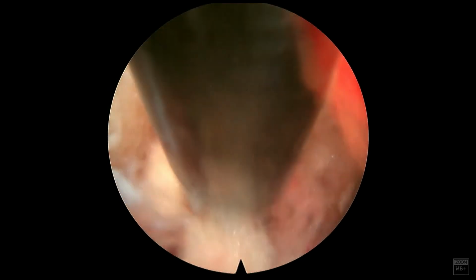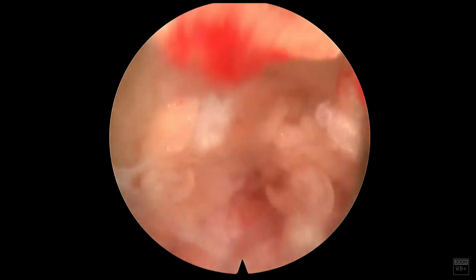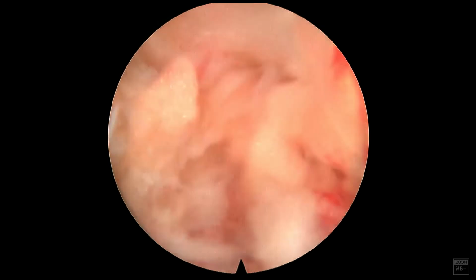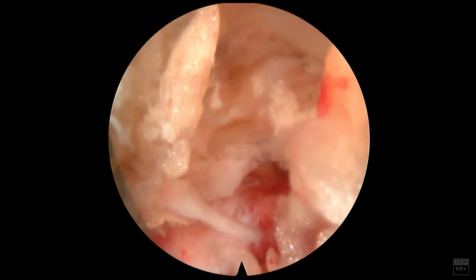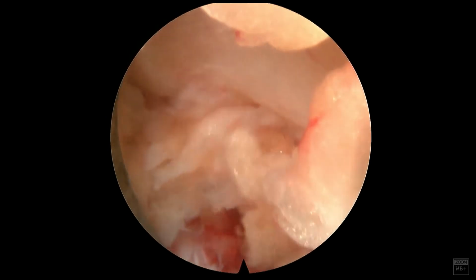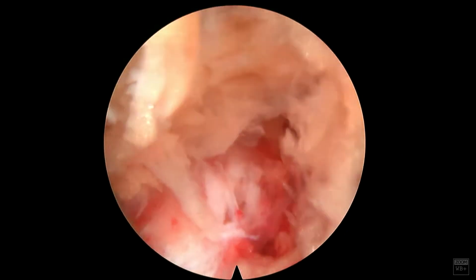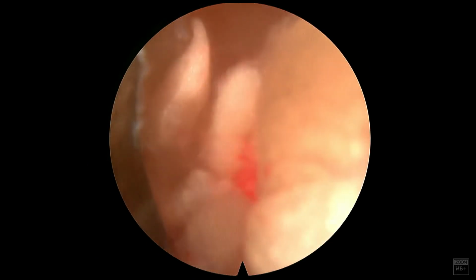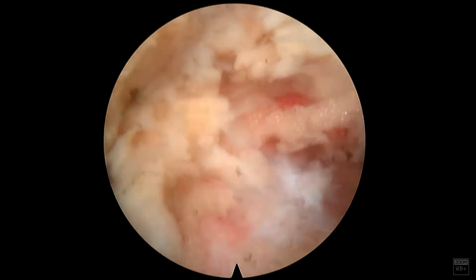A lot of these patients I don't indicate a fusion on, and I'm doing this endoscopic case just for conservative purposes. So I'm going to do some sort of decompression, whether it's a soft disc or a calcified disc. Some people may agree with that, some people not, but I think that's a nice thing about the Joymax, the ability to do that. So we'll fast forward for time purposes here.